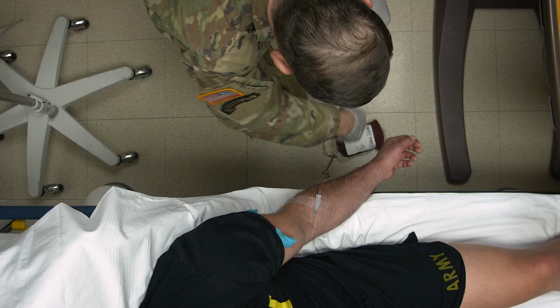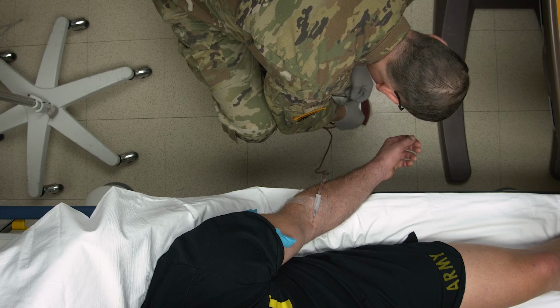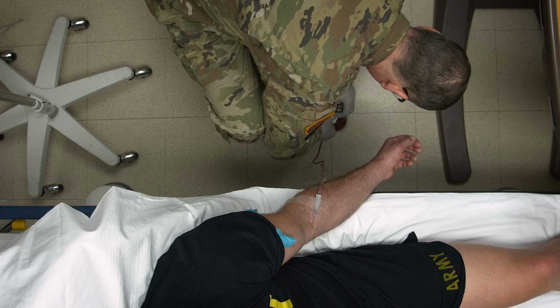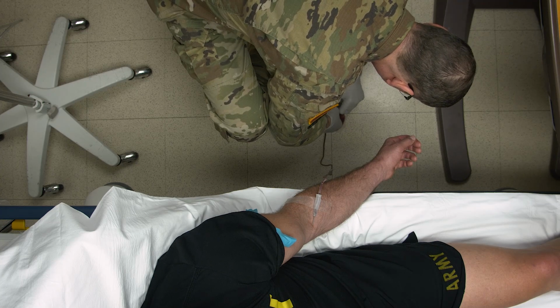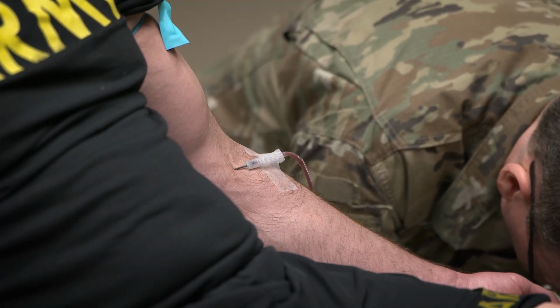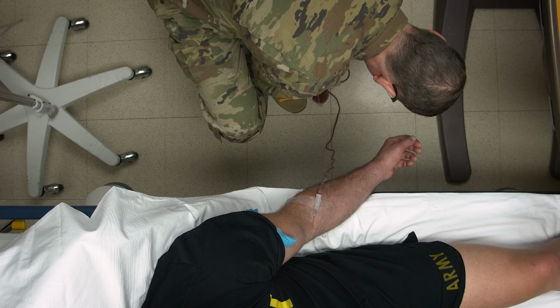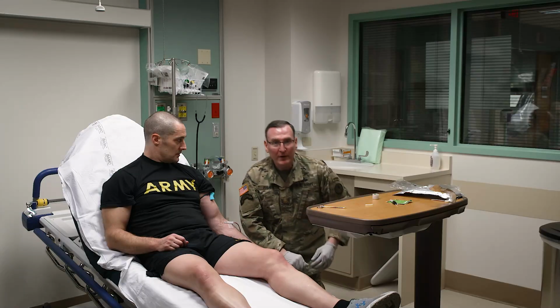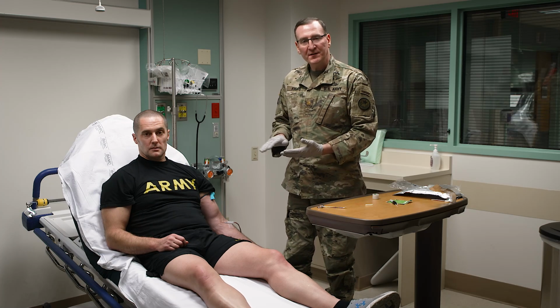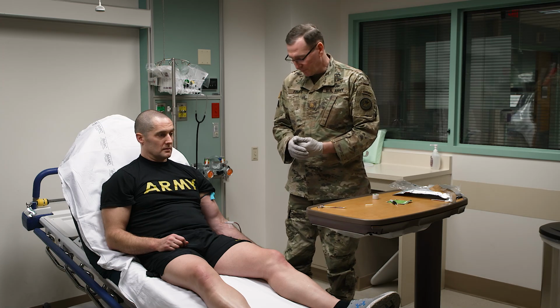So I'm going to go ahead and place this around the bag now. You don't have to place it immediately, but sometimes it does help if you feel more comfortable doing that. This goes around the long axis. All right, and we are full already. So it doesn't take that long as you have a good sized vein. It is properly placed, and that needle lays flat in there, and you have a good amount of area to where the bag can drop to in order to fill appropriately.